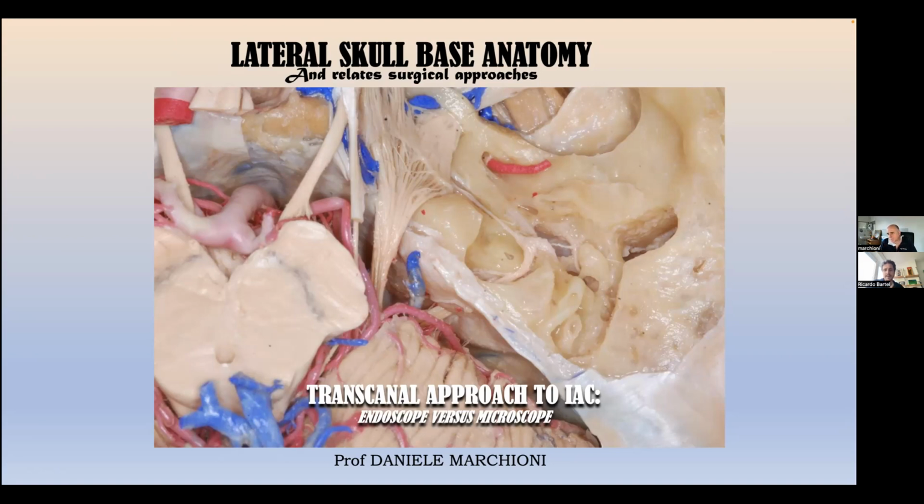Perfect. And in the translab approach, you more or less likely have to encounter the tumor in the lateral aspect of the IAC, right? So the first thing you encounter while you're drilling is the tumor, normally. Yes, it is the tumor. Okay.